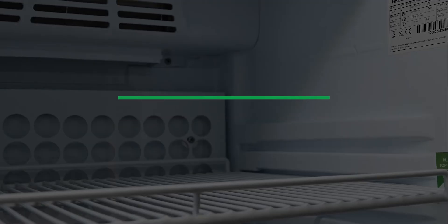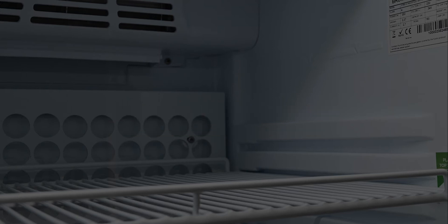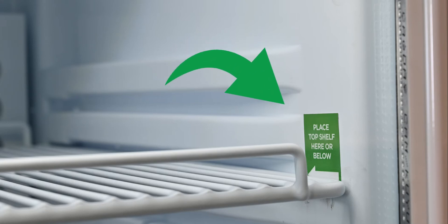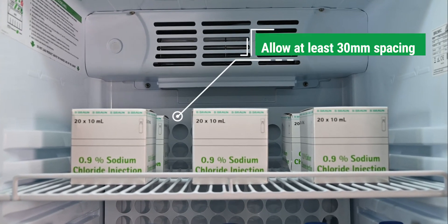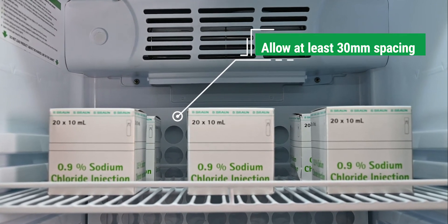Loading products. Please follow these simple rules when loading your sensitive products to ensure the temperature inside your Medi-Fridge remains stable and within the safe range. Position your top shelf at the marked location as indicated — it will assist with maintaining optimal air flow inside your unit. Before placing your products in the unit, ensure they are pre-chilled to the safe temperature range between 2 and 8 degrees. We recommend placing your products in the centre of the shelf, or distributing them evenly, allowing at least 30mm spacing between containers or perforated baskets to allow air circulation.